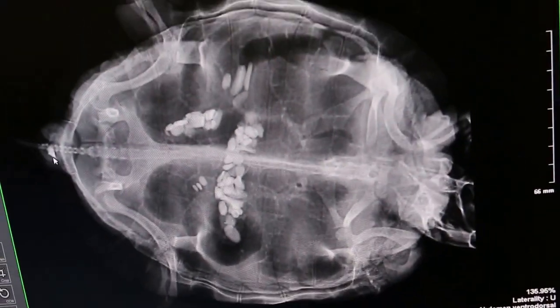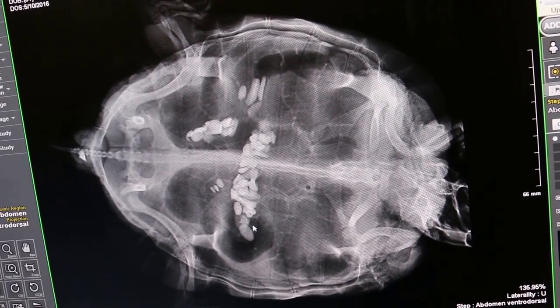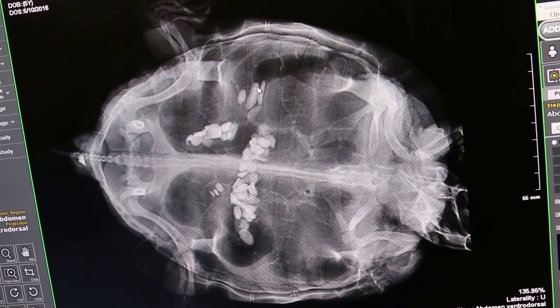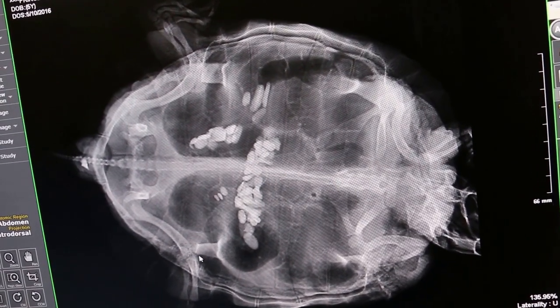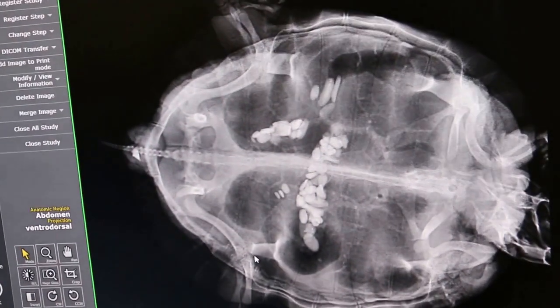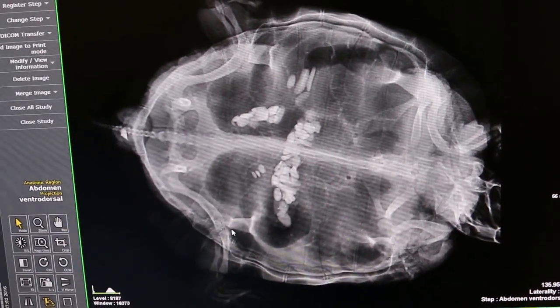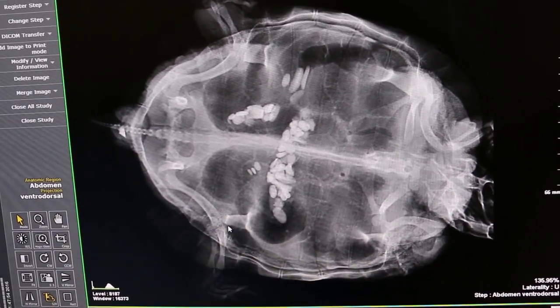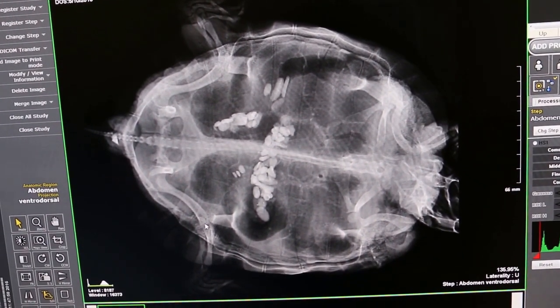There is a lot of gas in the intestines — you can see a lot of gas there because it was stuck for quite a long time. At least we know there are no well-formed eggs. I'll give oxytocin and antibiotics, and then hospitalize the animal.